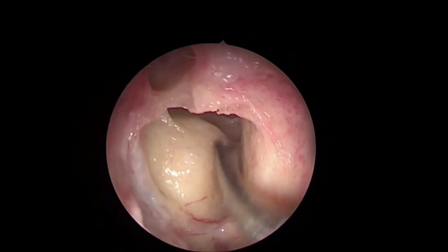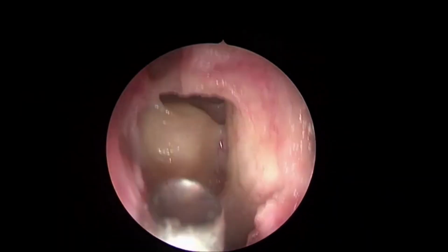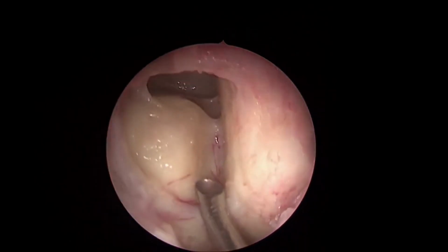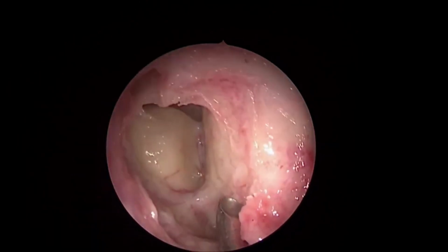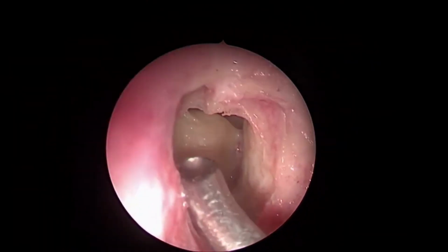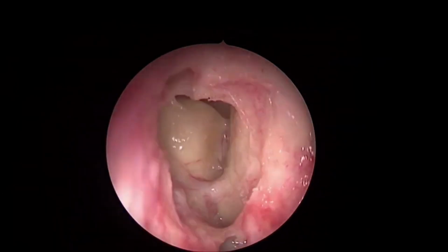So all this cellularity, we must sit with the CT scan for at least half an hour and run in a three-dimensional plane to understand what area we are operating upon. We need to be well versed with the three-dimensional anatomy of that region so that we don't commit any mistakes, cross our limits and give complications to the patient.